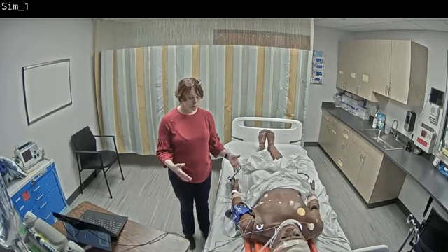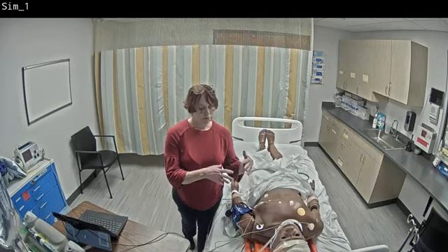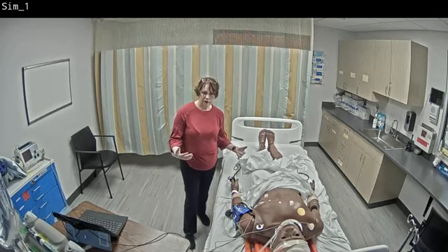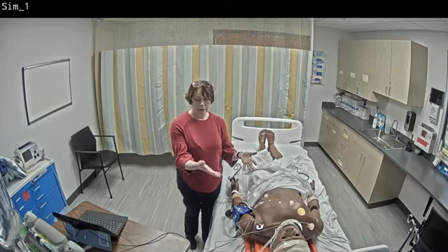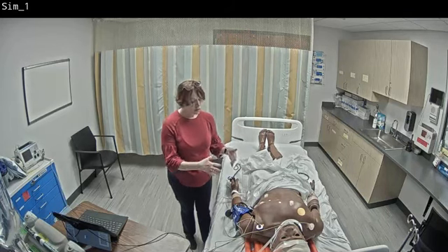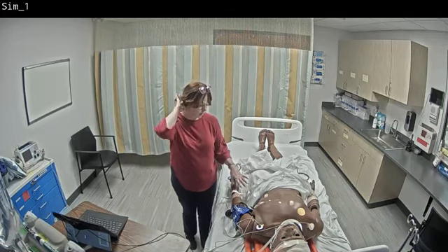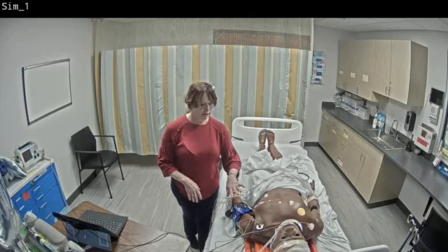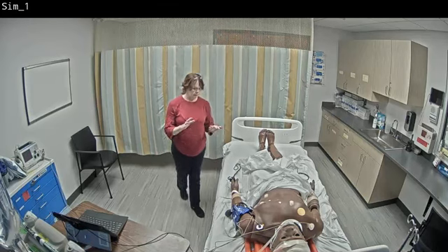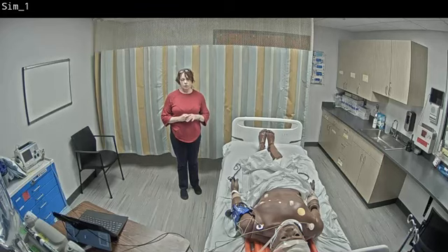When you come into the room, you're going to simulate coming and talking to your patient. You can talk to him like he is nonverbal, or like he might be able to hear you but is not responding to you. Pretend that's the situation, and go through those steps of talking to your patient and verifying. That's how your simulator is going to run for skills lab. If it is a simulation, we would probably be talking to you as the patient.